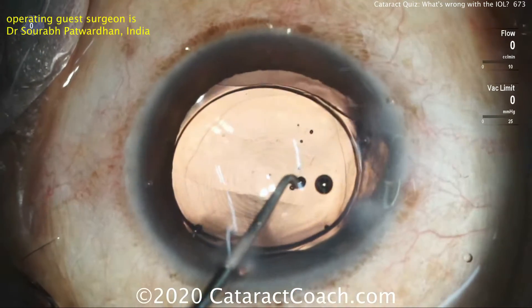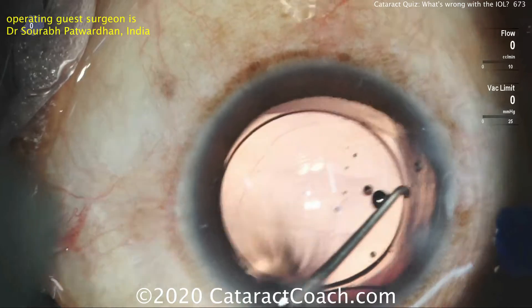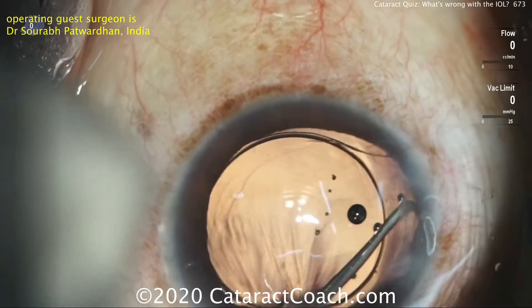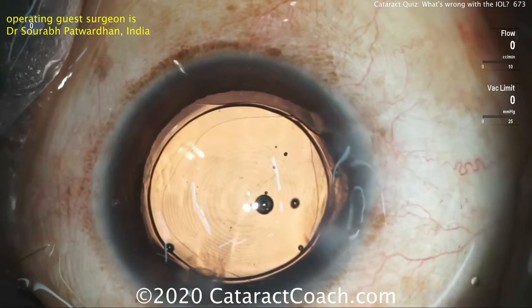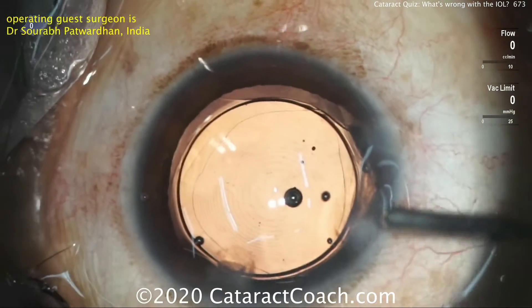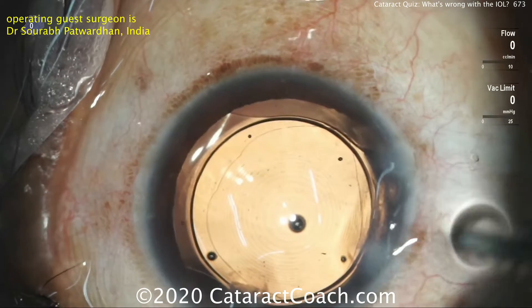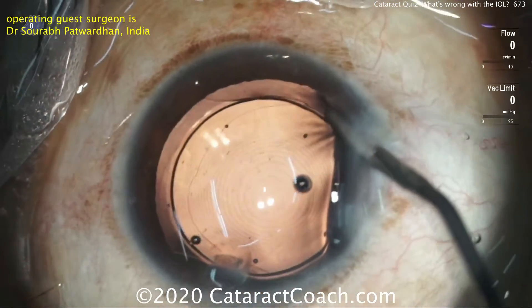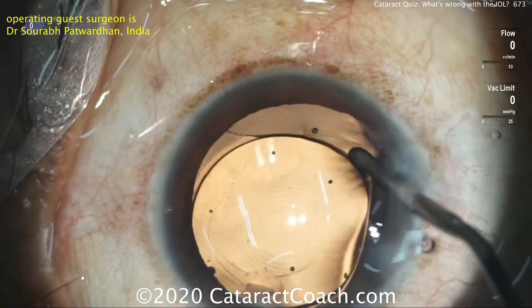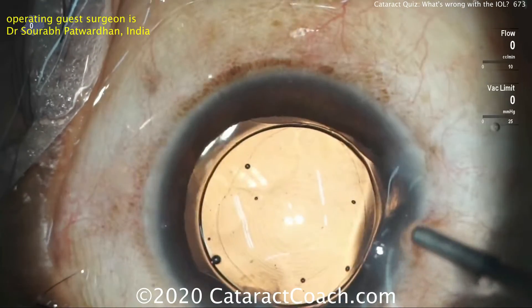Now the surgeon pauses for a moment, looks around a little bit — look what happens next. The surgeon says he needs to do something different. At this point, he's going to put more viscoelastic in the eye, above the IOL and also behind the IOL optic. And the reason is this IOL is upside down in the eye — it got flipped.